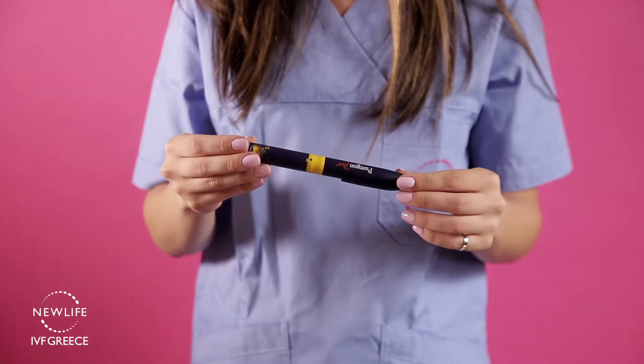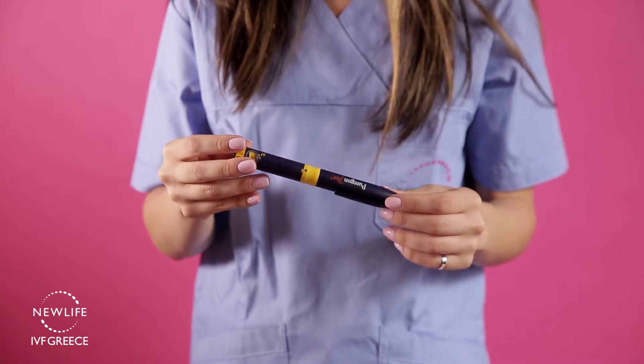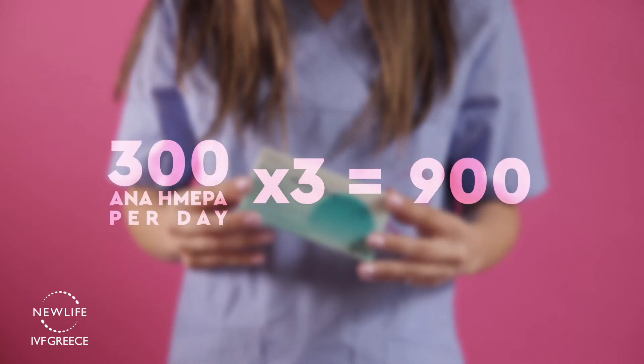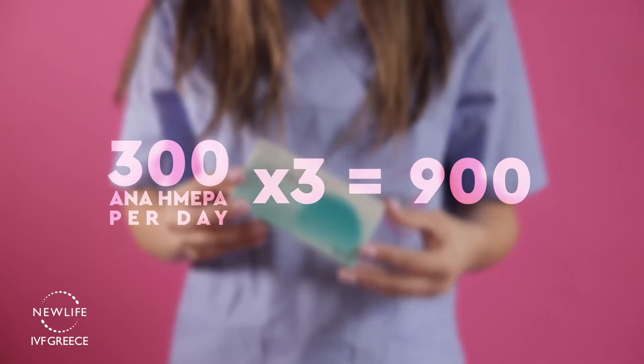You should be injecting daily the exact units instructed by your coordinator. For example, if you're instructed to perform 300 units daily, one pen of 900 units should last you for three days.